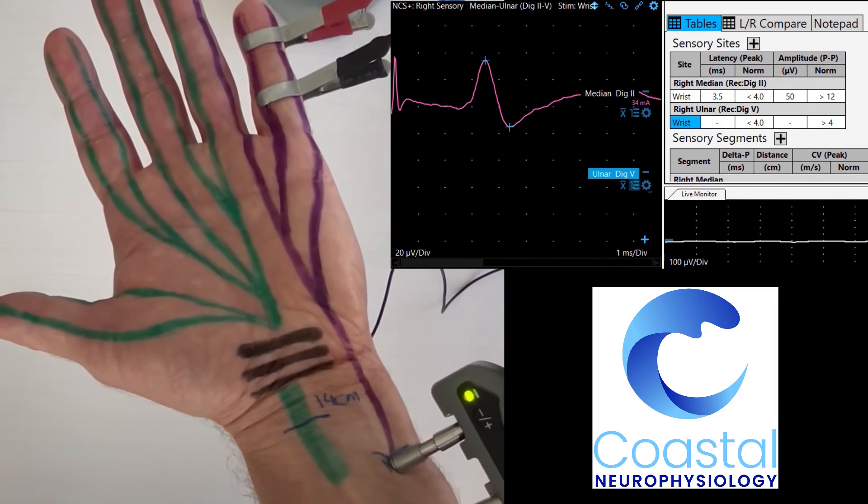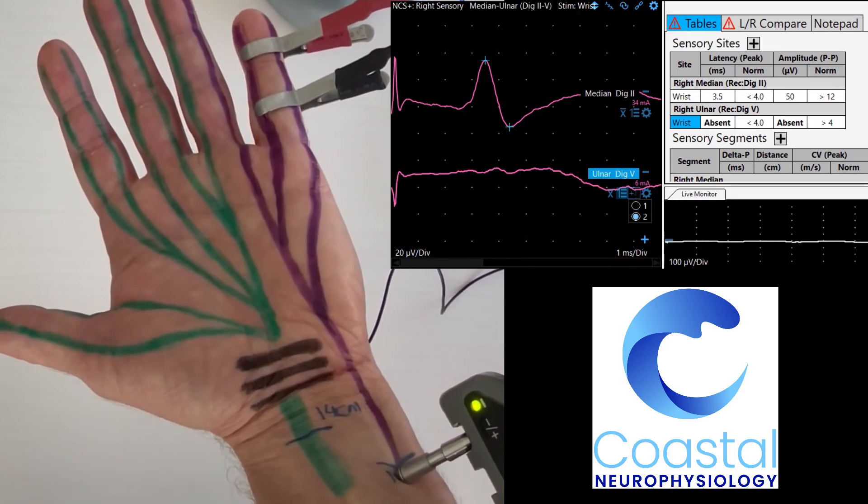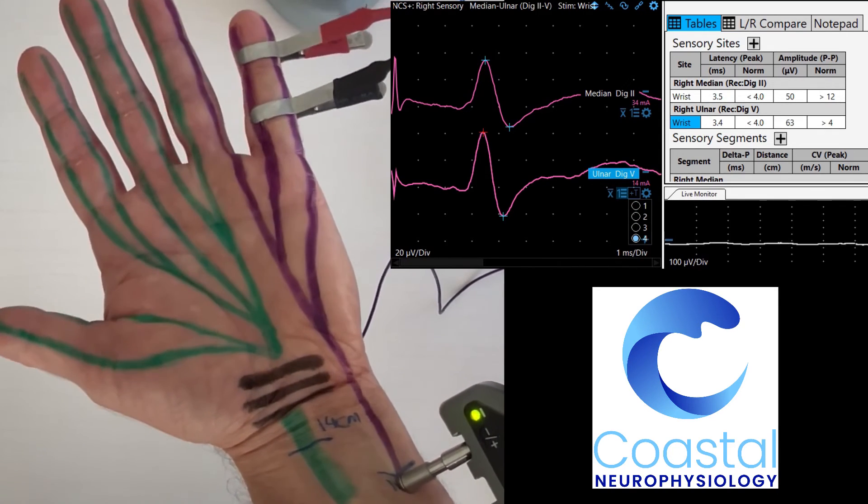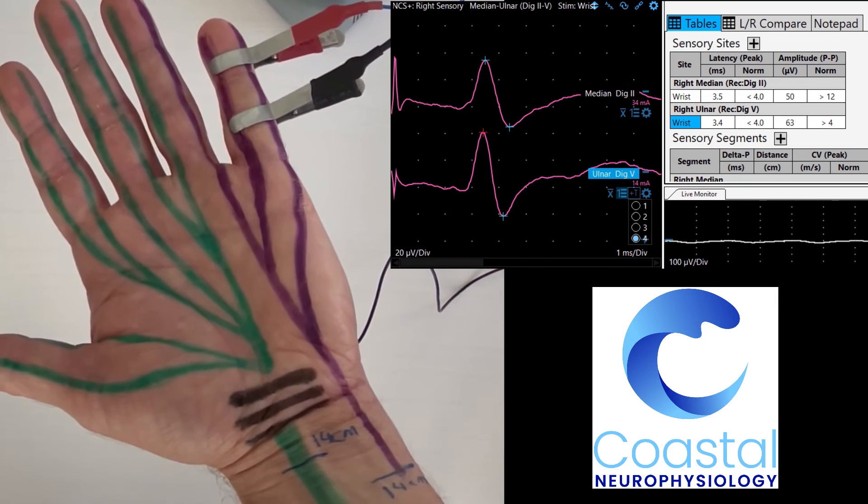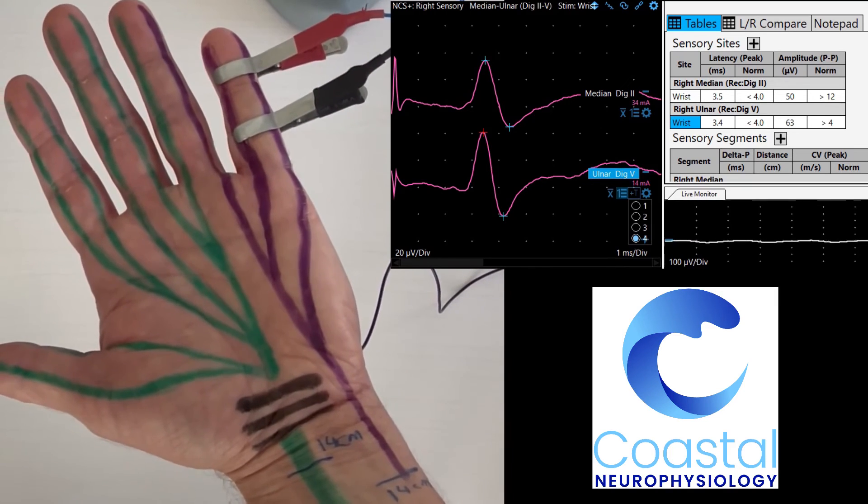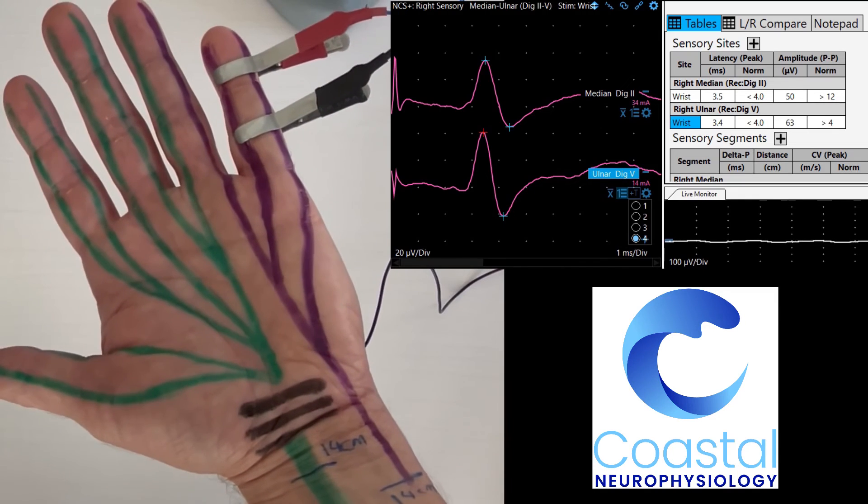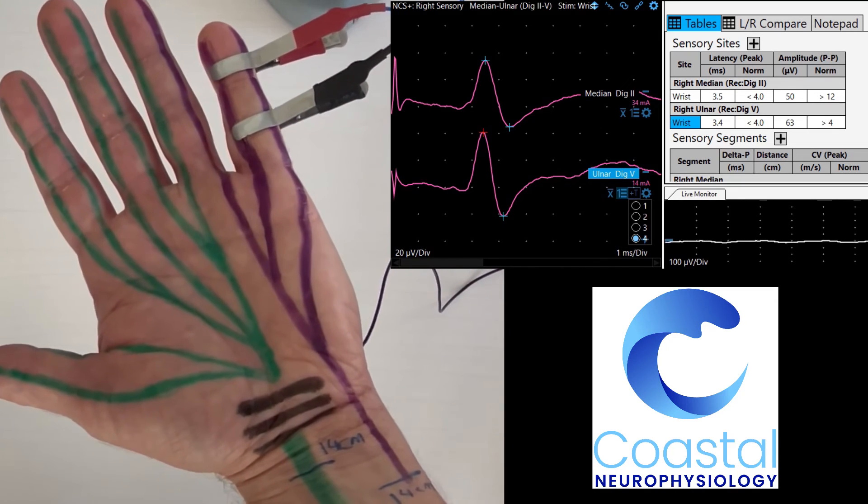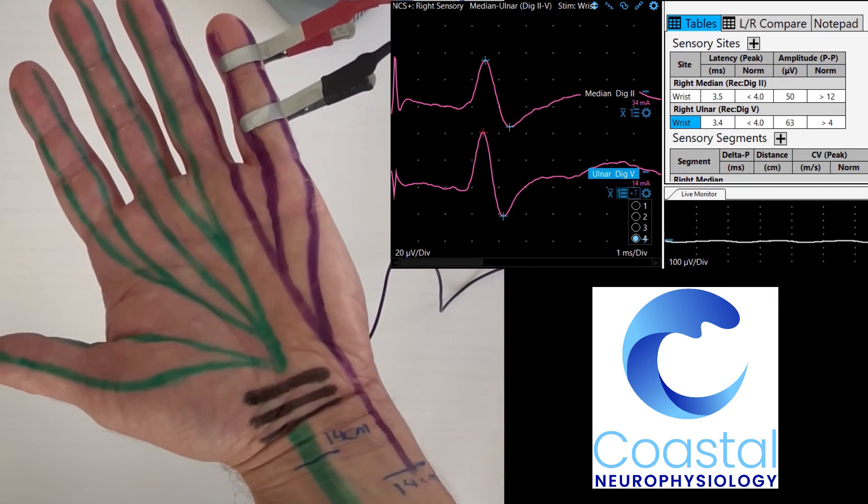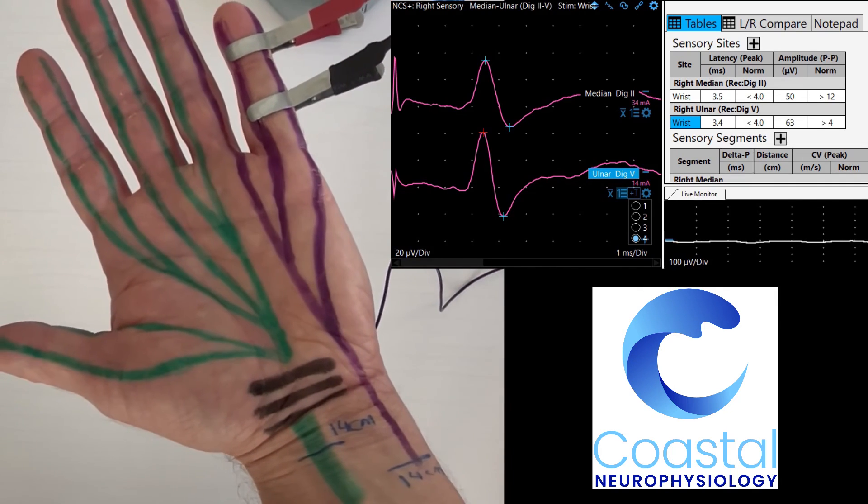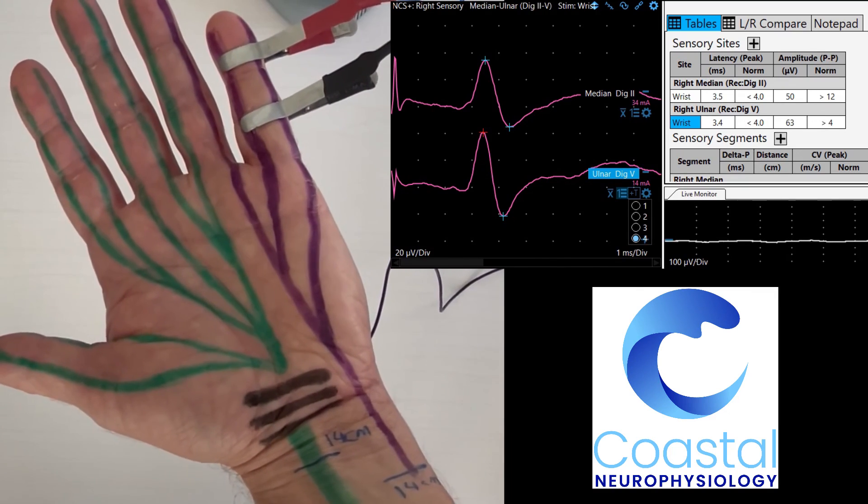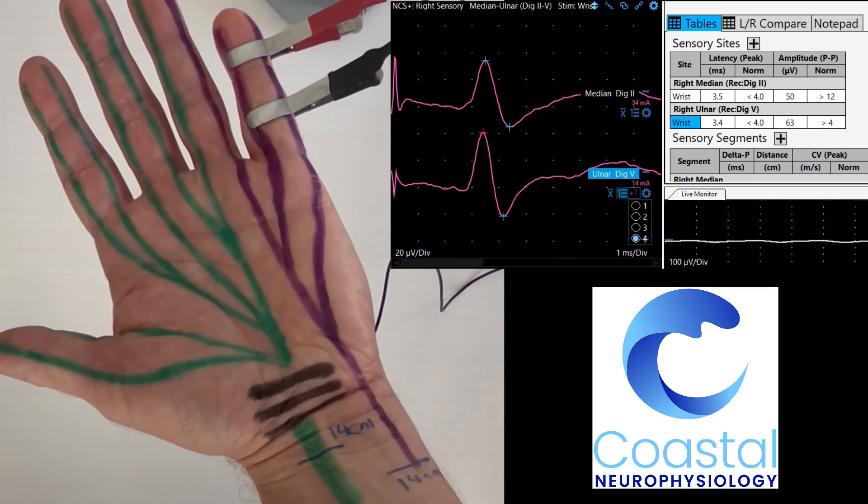If I stimulate the ulnar nerve electrically at the wrist and as I increase my signal you will see an action potential occur. You can see the ulnar nerve signal on the screen is very similar in shape, very similar in size and very similar in latency to the median nerve. These two nerves are essentially the same in terms of how they're conducting even though the median nerve conducts through the carpal tunnel and the ulnar nerve does not. In this setting this person does not have carpal tunnel delay.